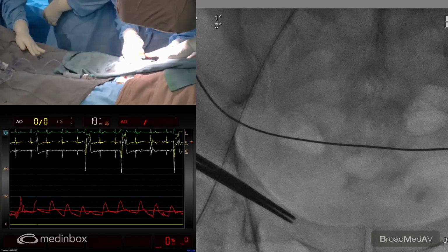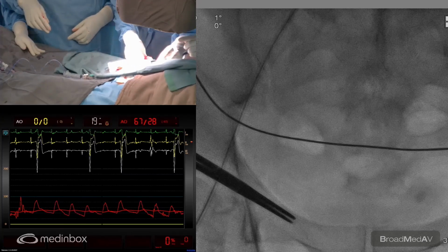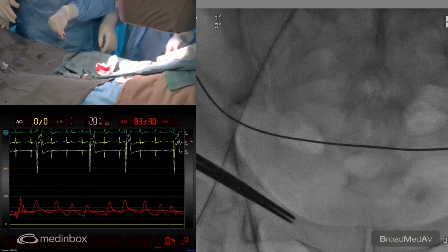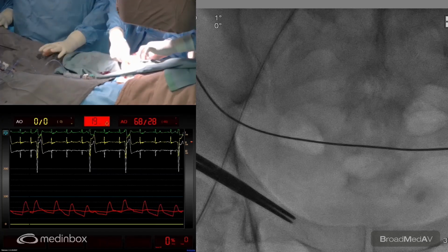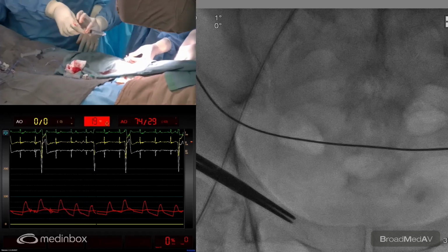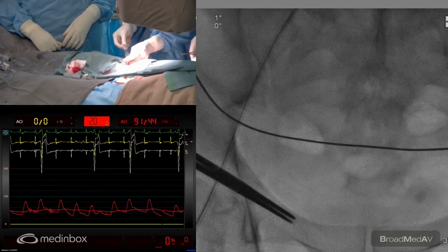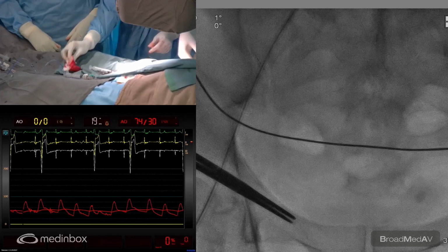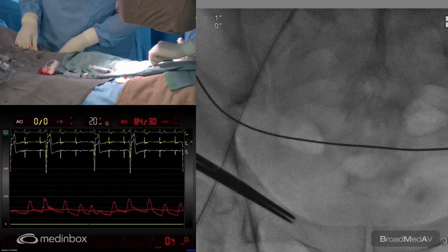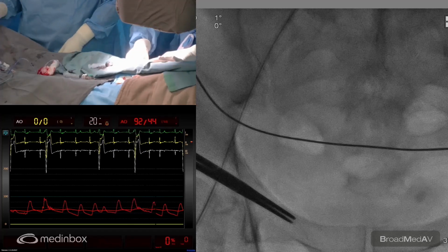JR. So we'll take a JR with an Amplatz wire. So the important thing is to get good access. Now we flush the whole thing. We've given 6,000 units of heparin. We got your ProGlides in, and now we're going to get a JR with an Amplatz wire for then sequentially dilating.